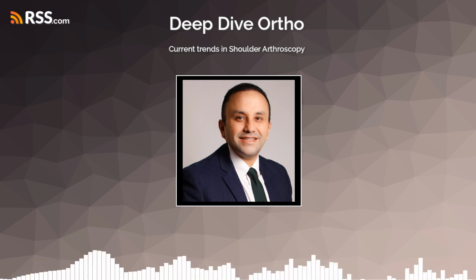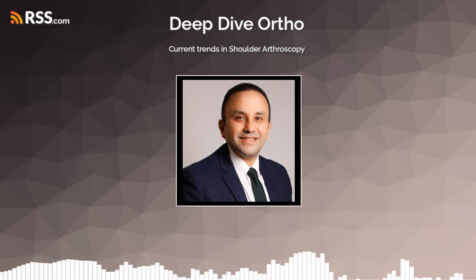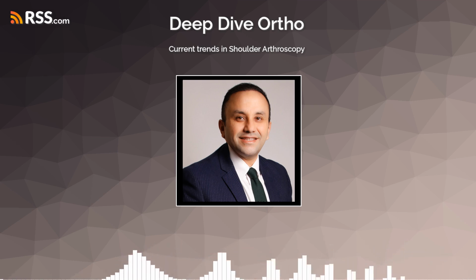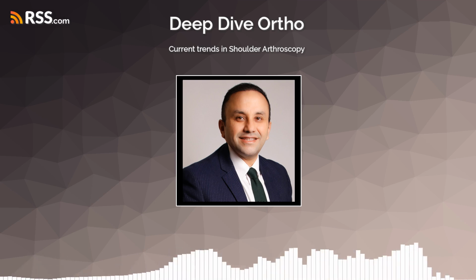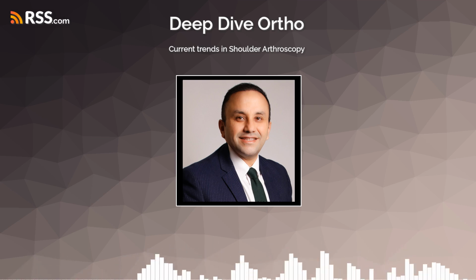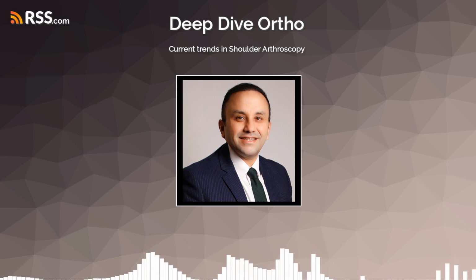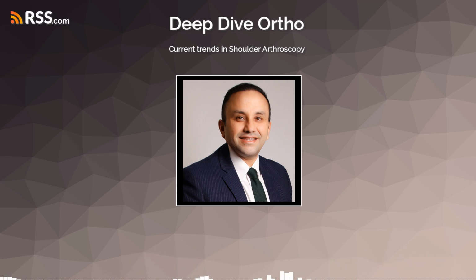Sometimes, loose fragments of cartilage or bone can float around inside the shoulder joint, causing pain and mechanical symptoms like catching or locking. How are those addressed? Arthroscopic removal of these loose bodies is an excellent and often the preferred alternative to traditional open surgery. Why is it better? It allows the surgeon to thoroughly visualize the entire inside of the joint, find all the fragments, even ones hiding in corners, and precisely remove them with minimal damage to the surrounding healthy tissues. Smaller incisions, quicker recovery usually.